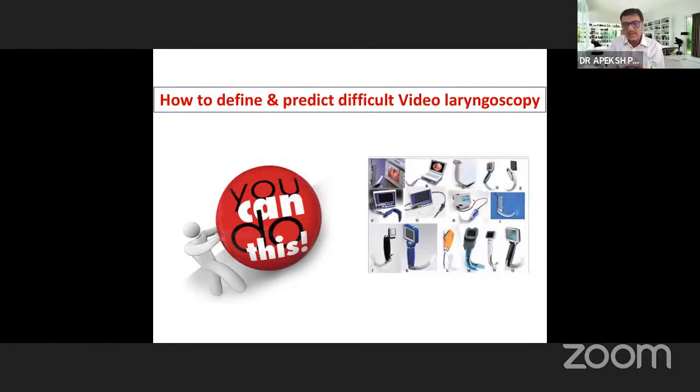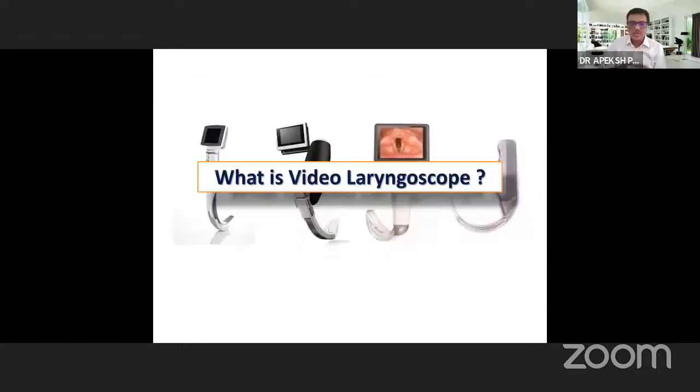What are the criteria for predicting difficult laryngoscopy? Those are for laryngoscopy, not for predicting difficult video laryngoscopy. So we need to define that criteria. To understand that, we need to understand what a video laryngoscope is.